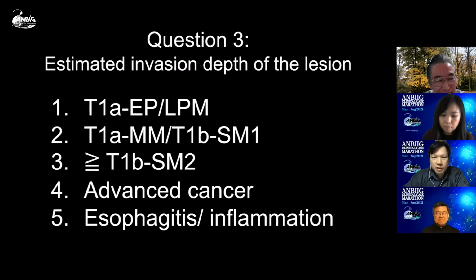Okay, question 3: what is the estimated invasion depth of the lesion? Please vote.